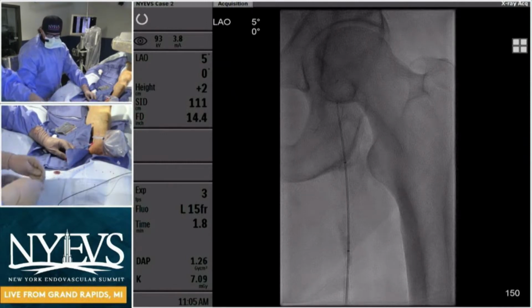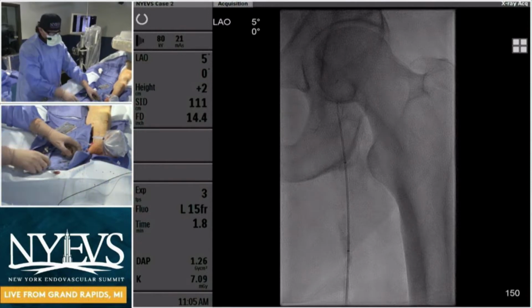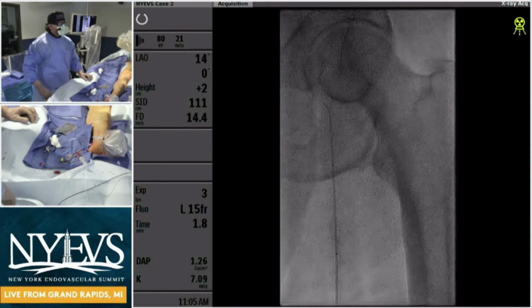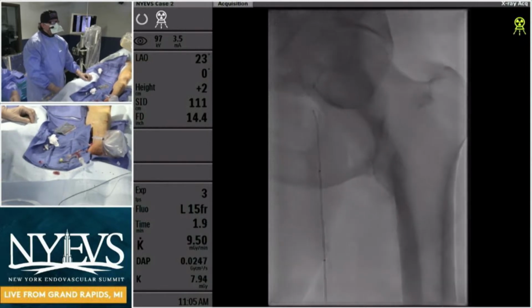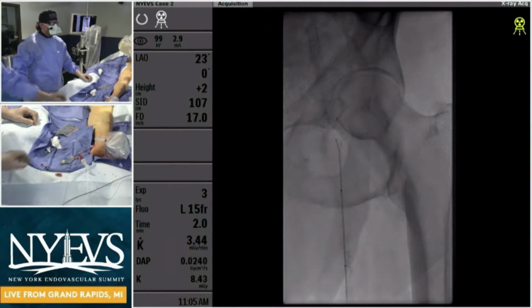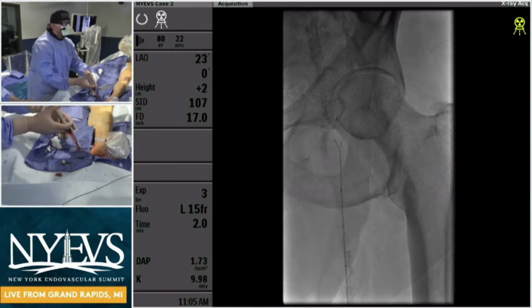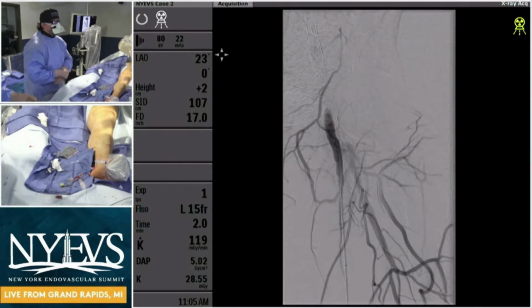I know you guys have pioneered this technique, and for a lot of us, I know everybody's going pedal and coming up, but generally for just crossing and externalizing the wire and working from above. So it's very interesting to see your approach on how you're doing this. And so the advantages. Yeah, and we published a large case series in CCI, I believe, a year ago. No, actually, I'm sorry, 2 years ago. We had the comparison between traditional approach, TAMI approach, and the dual antegrade and retrograde approach. The results are pretty encouraging, and I know that the results have been repeated with other people.